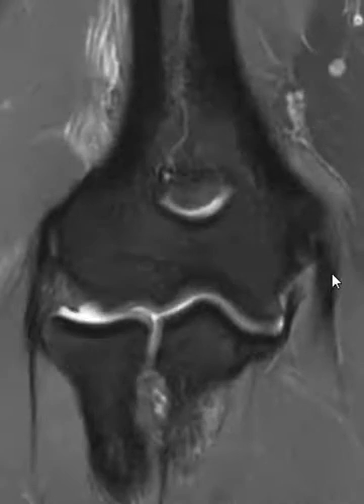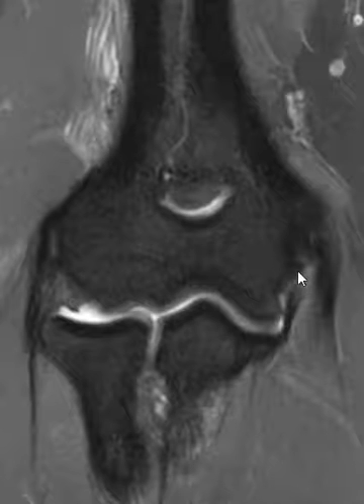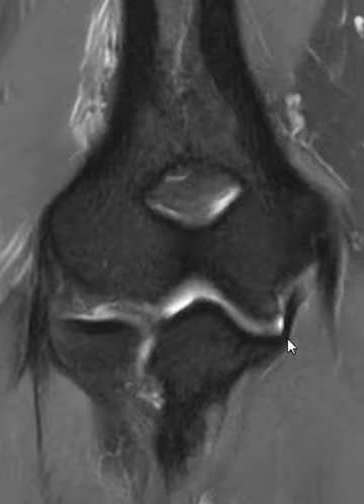If we go to the anterior band, it's over here on this view. Right here where it attaches, it's just poorly defined and thickened. So this patient has a partial tear of the medial ulnar collateral ligament at the humeral attachment, and the distal attachment to the sublime tubercle appears normal.